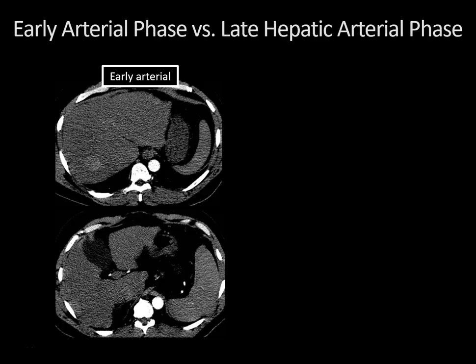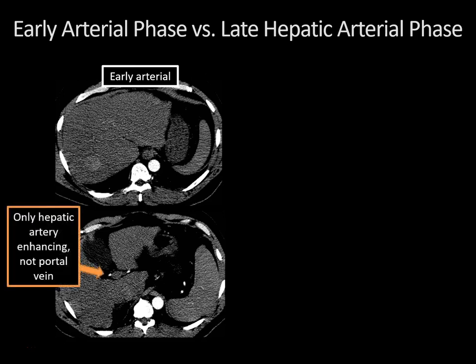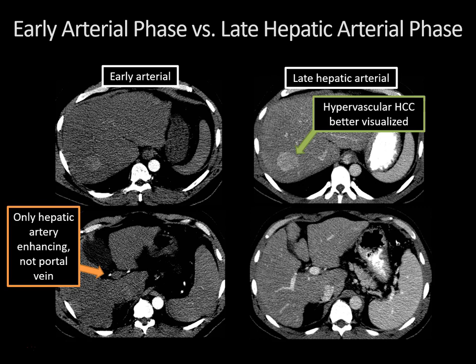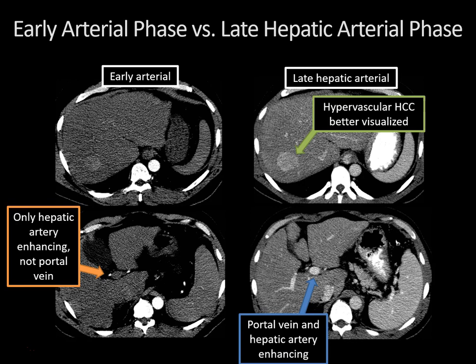Here's an example of why the difference between early arterial and late hepatic arterial phase is so crucial. The two left-hand images show an early arterial phase study — the aorta is markedly enhancing, and so is the hepatic artery, but there's nothing in the portal vein. You might initially think this is the best phase to pick up hypervascular liver lesions, but a scan done a few months later on the same patient shows this hypervascular hepatocellular carcinoma much more clearly because the portal vein is now nicely enhancing alongside the hepatic artery — a true late hepatic arterial phase.